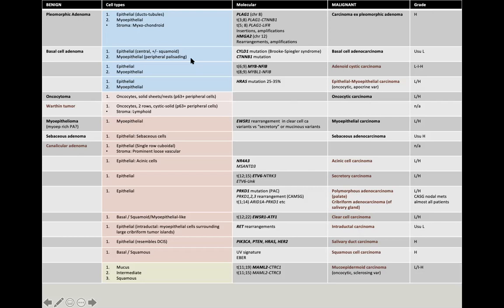So this is kind of how I understand salivary tumors. The other way in which I understand them is by how many cell types they have histologically. Do they have two cell types, recapitulating both the epithelial and myoepithelial components of the normal ductoacinar system? Do they have a single cell type, recapitulating only the myoepithelial or only the epithelial subtype?